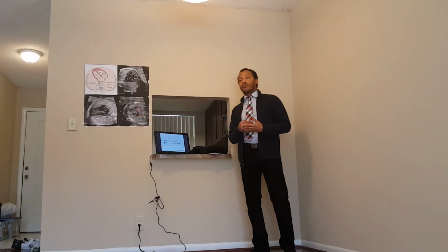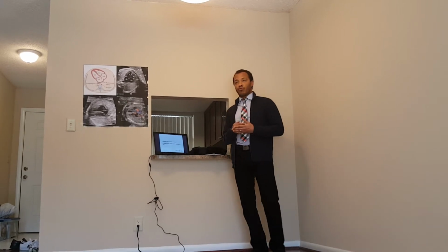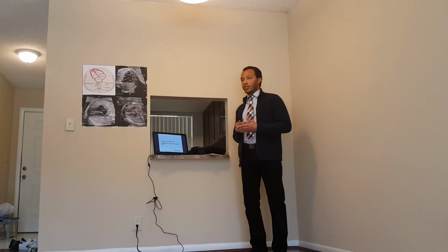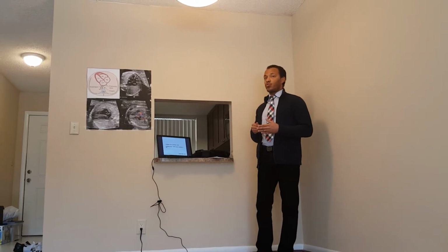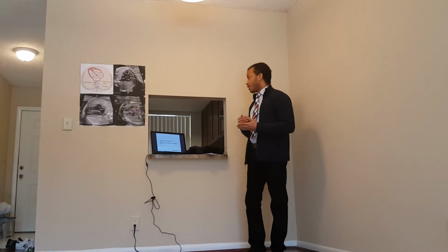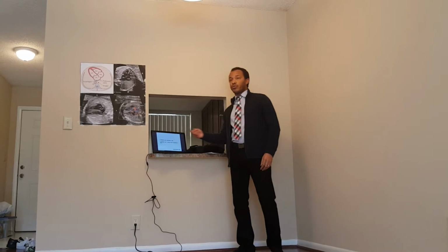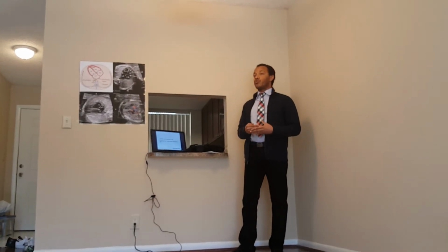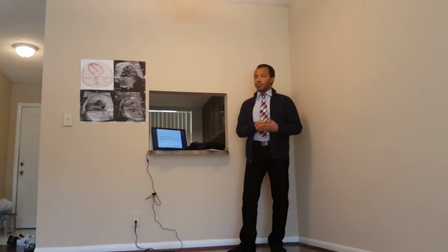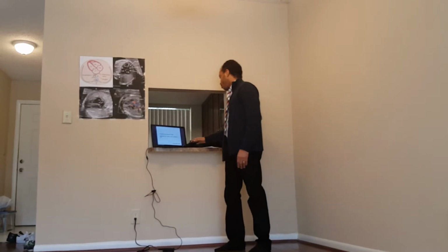But the four-chamber view must be coupled with the evaluation of the outflow tracts, which are the aorta and the pulmonary artery. By doing so, you increase the sensitivity of your evaluation. The sensitivity is about 48% when you use the four-chamber view alone, and it can reach 78% when you couple the four-chamber view with the assessment of the outflow tracts.